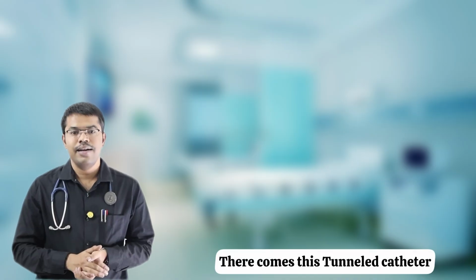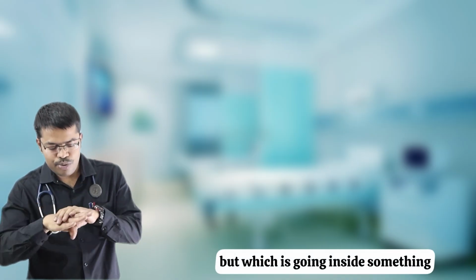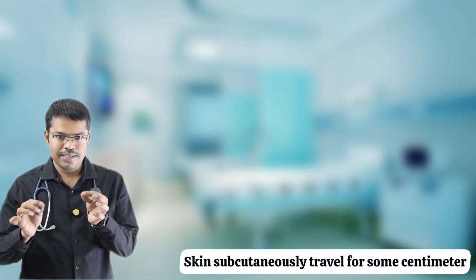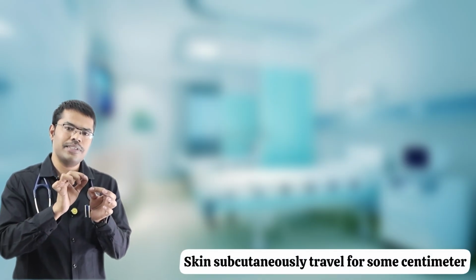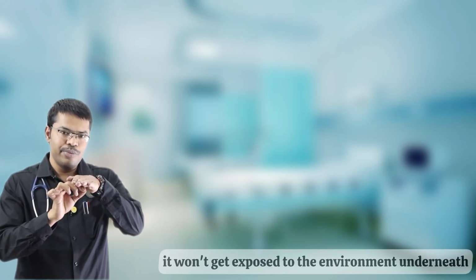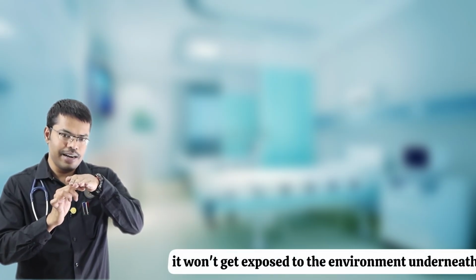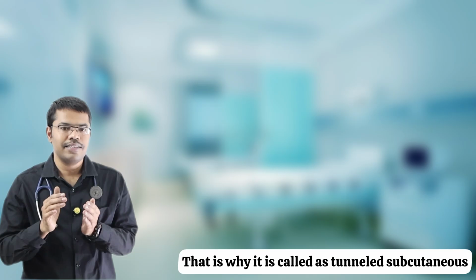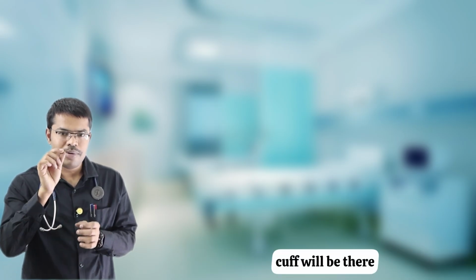There comes this tunneled catheter. Tunnel. What is a tunnel? A tunnel is nothing but something which is going inside something. A common word. What does this Permacath do? It travels subcutaneously for some centimeters, 5 or 6 centimeters. It won't get exposed to the environment. Underneath the skin only, it enters the vessel. That is why it is called tunneled.